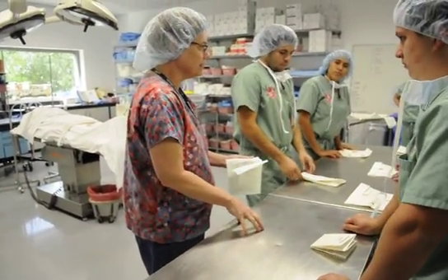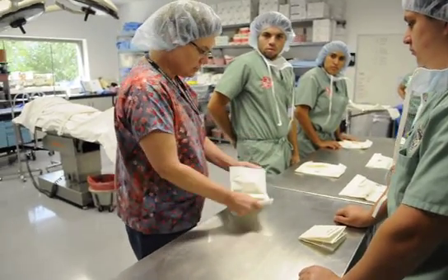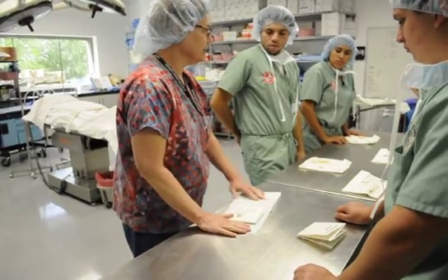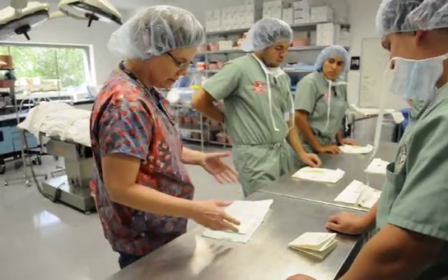But if you're going to open gloves not using a sterile field, all you have to do is open it and just lay it there. If you eject it, that means it goes scattered across, and it's just more work for you.